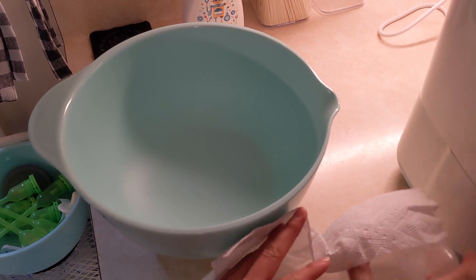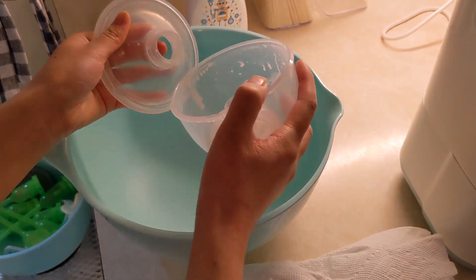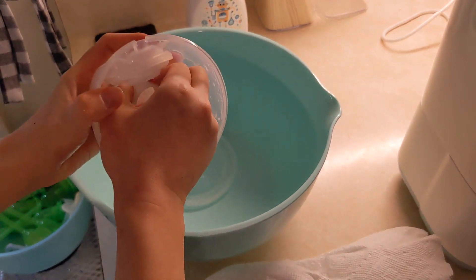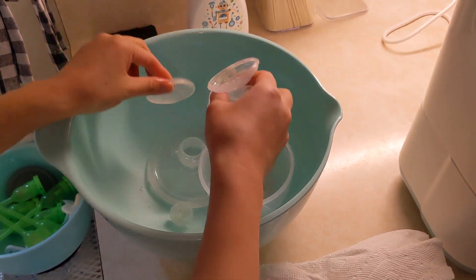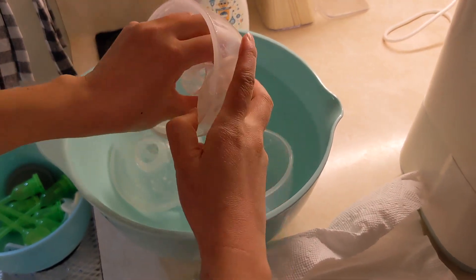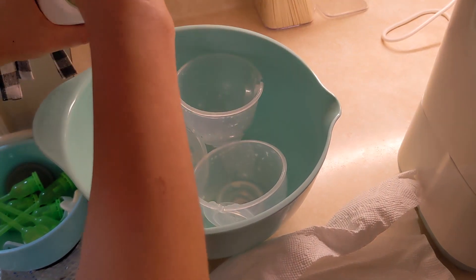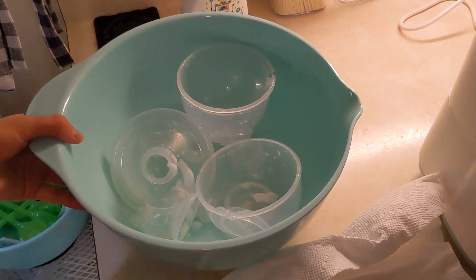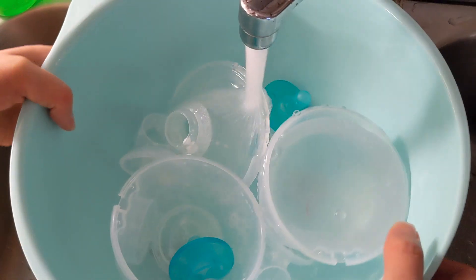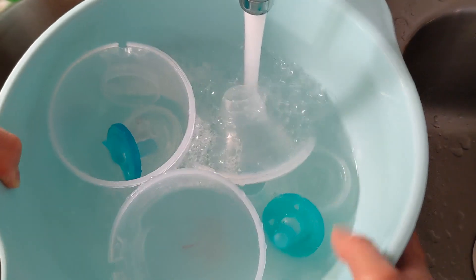At the end of the day I disassemble the breast pump — here's the flange — and wash everything with soap, letting it soak together with baby bottles or pacifiers, then run it all through the sterilizer.